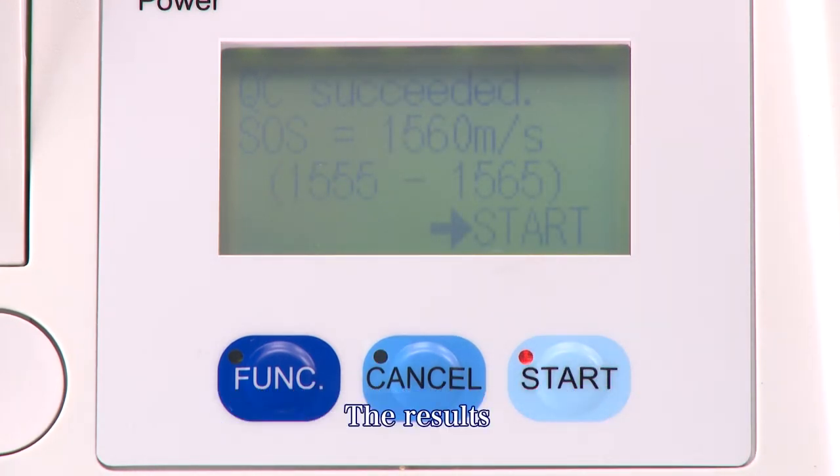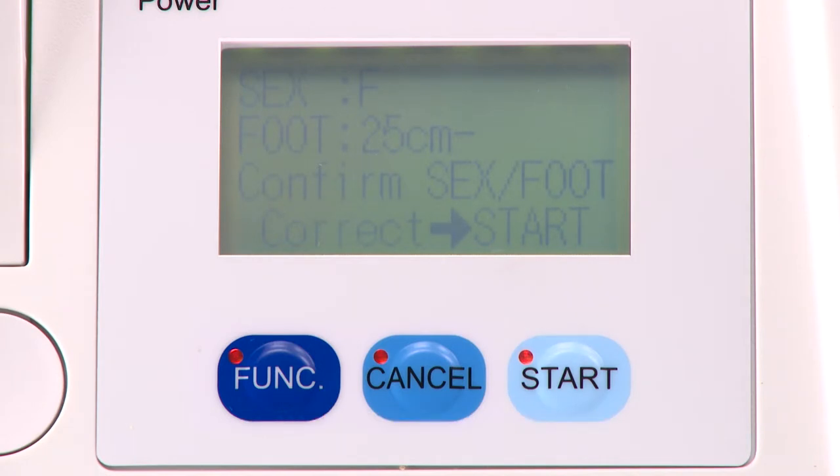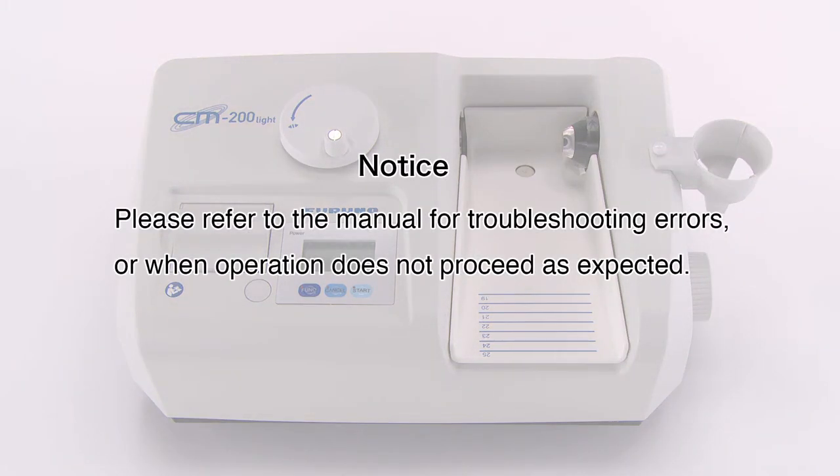Once the quality control measurement is completed, the results are displayed. Press the start key to save the results. This completes the quality control measurement. Please refer to the manual for troubleshooting errors or when operation does not proceed as expected.